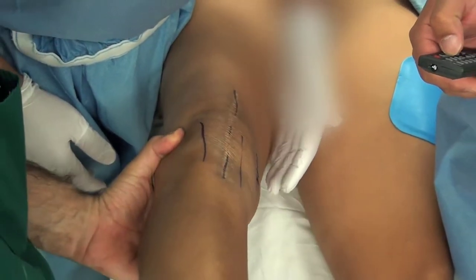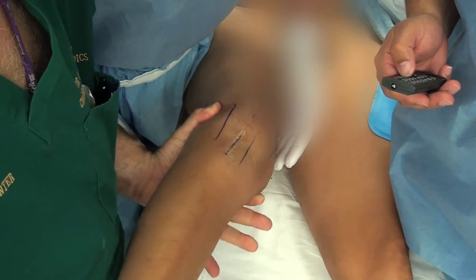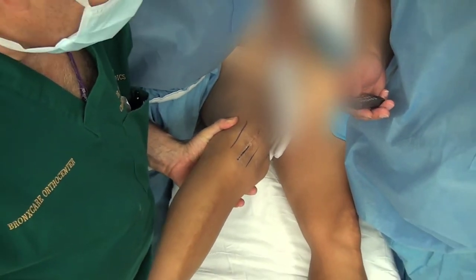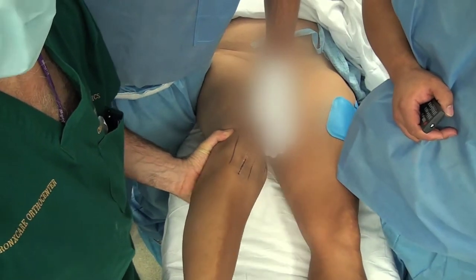Not so bad this way. Varus, not so bad. But valgus, she comes out, look. See that? This is all opening. I'm not moving the femur.